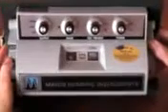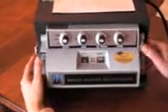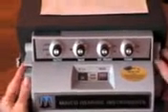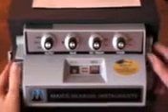What I prefer to do — it takes a little longer but you only have to do it one time — is actually find my threshold. I'm going to go down so you can see this. I present tones and find the softest level I can hear. In the left ear: 10 dB at 1,000 Hz, 5 dB at 2,000 Hz, and 5 dB at 4,000 Hz. Even just checking one frequency would be okay, but I tend to go to the other side too.